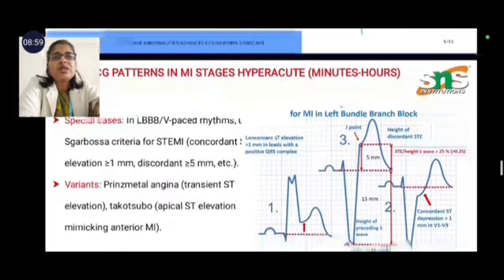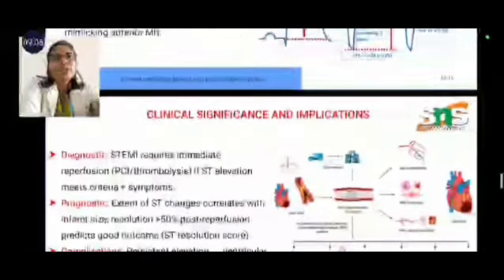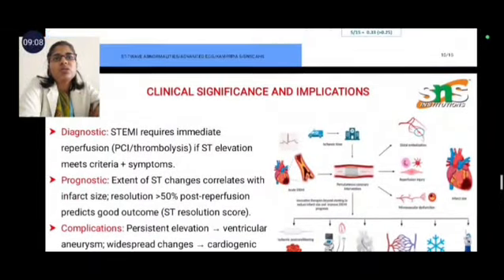So it is also called myocardial infarction, inferior wall MI. Pain is also noted. So mostly significant is that PCI or thrombolysis can be permitted, if the ST elevation is made with the criteria and symptoms also. Here the patient is planned for PCI.